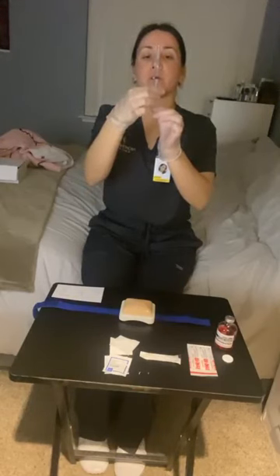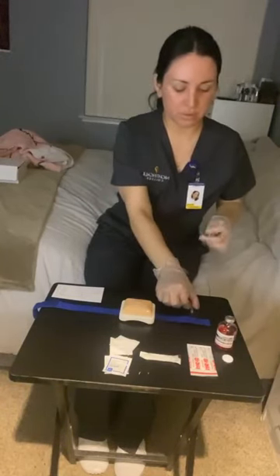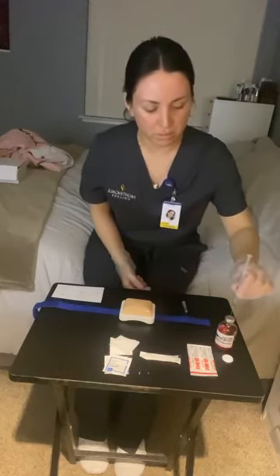of 1.5. I'm going to take the cap off, place it into the vial.